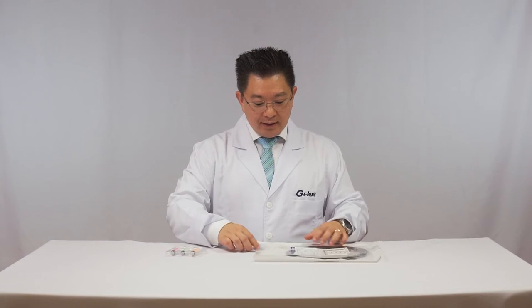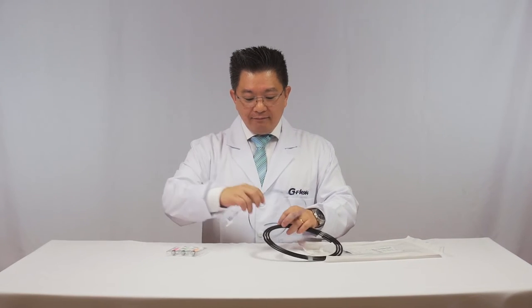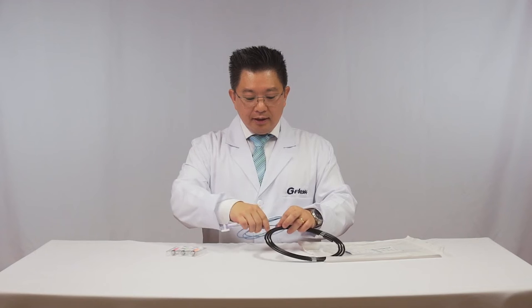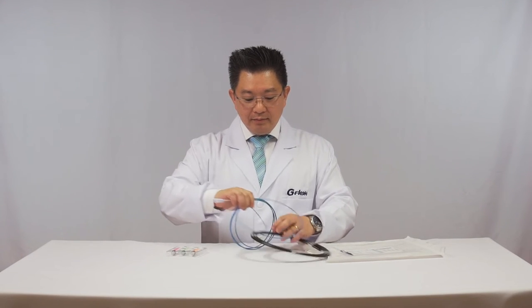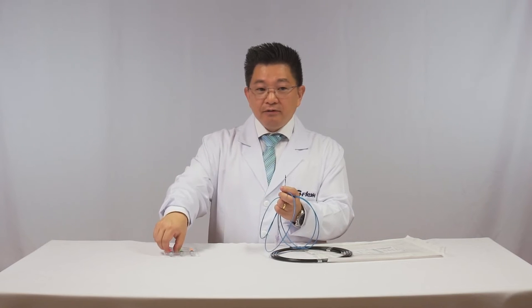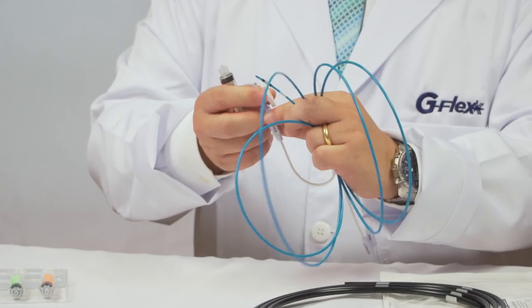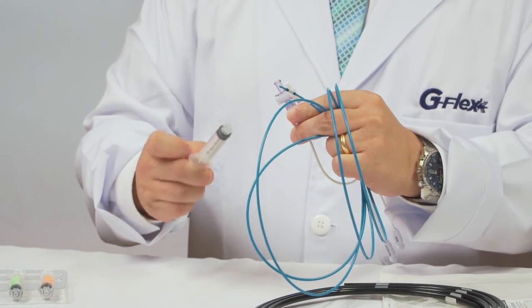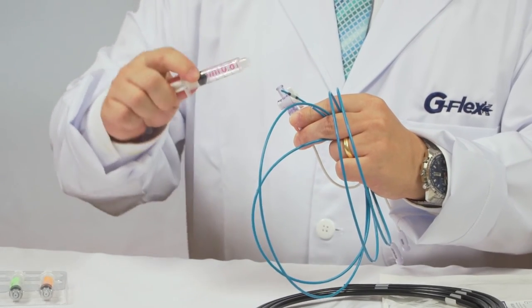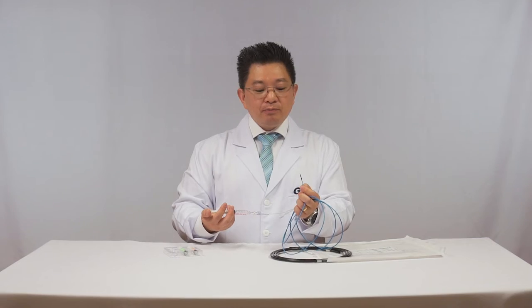G-Flex is providing a new extraction balloon that you can inflate up to 18 mm — it's very huge. It's perfect for doctors that prefer to dilate the papilla using a TTS balloon and extract the stone without performing conventional lithotripsy.